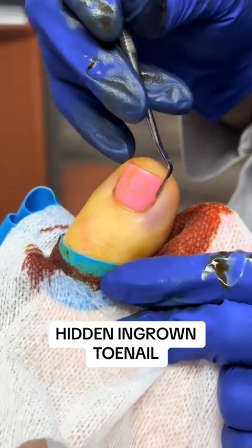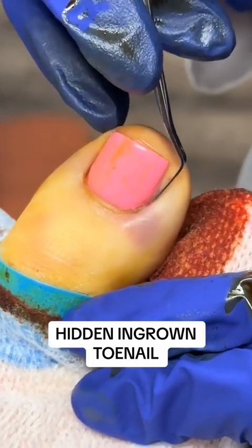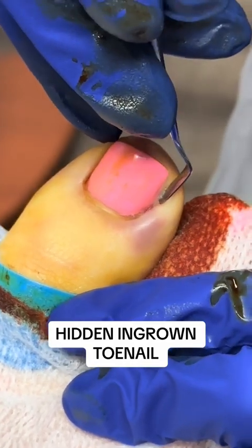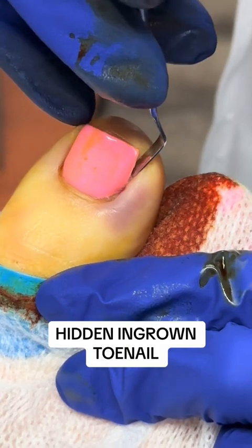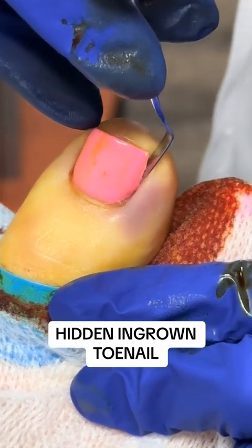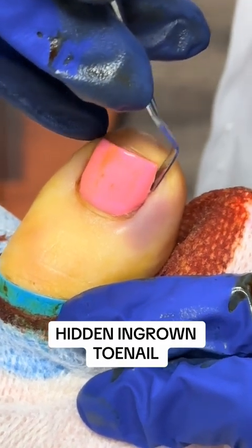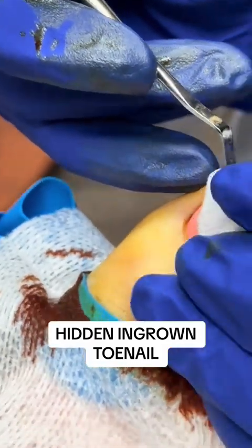So now that she's numb, I look in there and you can't quite see, but there was pus first off. And truly, there is nail all the way back there. So her pedicurist did a pretty decent job and took the nail off here. So it doesn't look like it's ingrown, but back here, there is in fact nail and it goes all the way. So let's see if we can see.